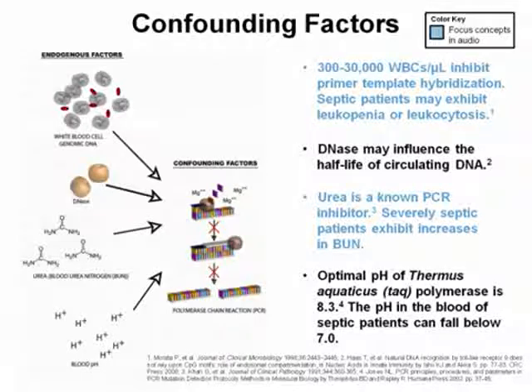Although these two potential confounding factors in the black text can potentially pose as threats to pathogen detection, less is known about the extent of interference or inhibition on nucleic acid recognition.